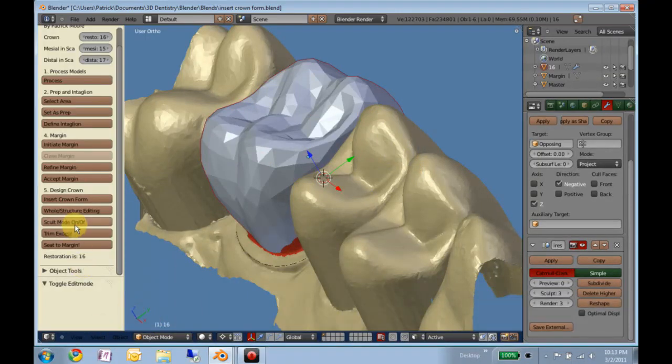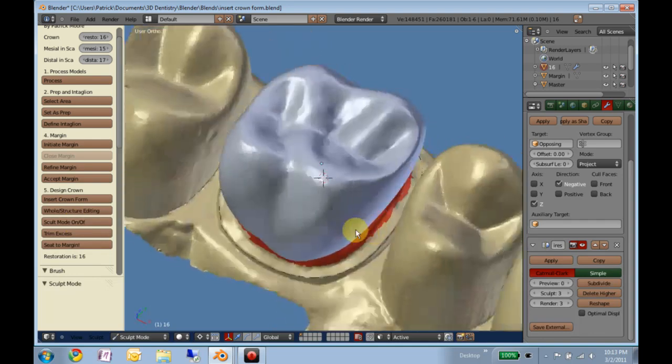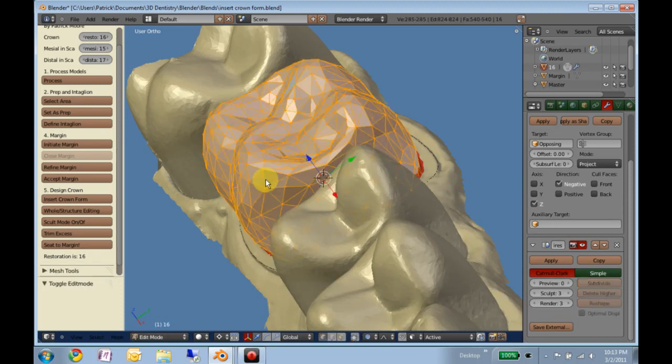One way we can see that is by going into sculpt mode. It's a much nicer item. But by having a set of control points, it becomes much easier to control the gross overall size and geometry of the crown without having to micromanage a bunch of vertices. So we'll go back here.